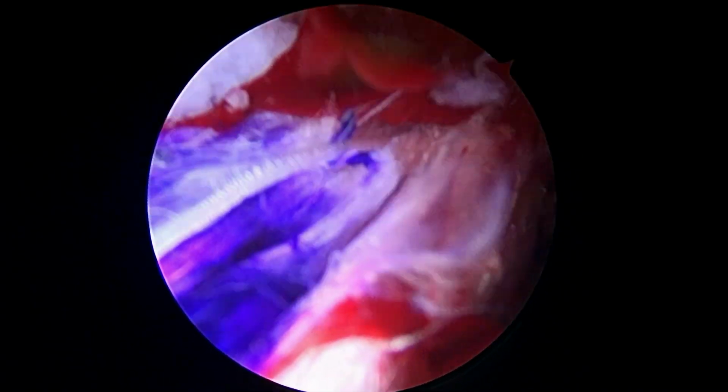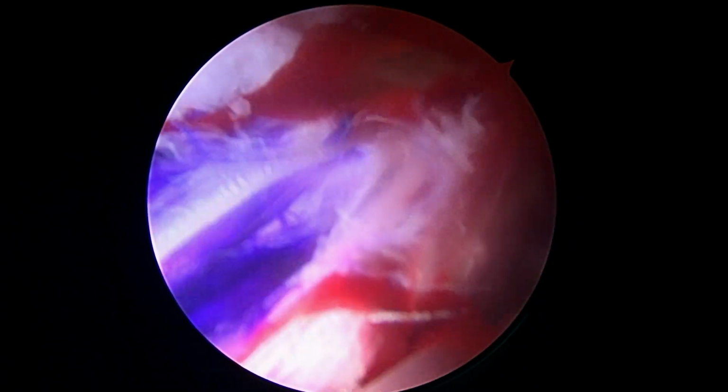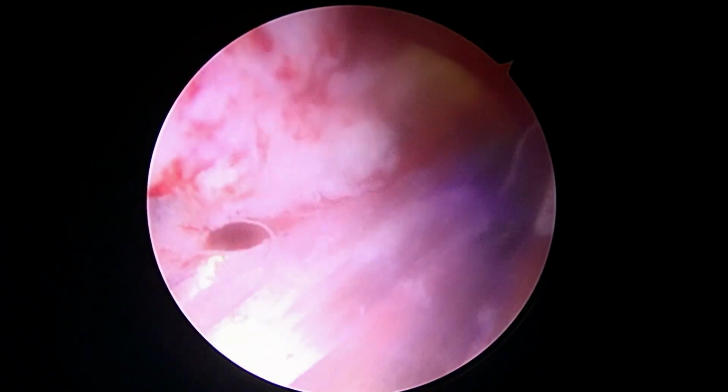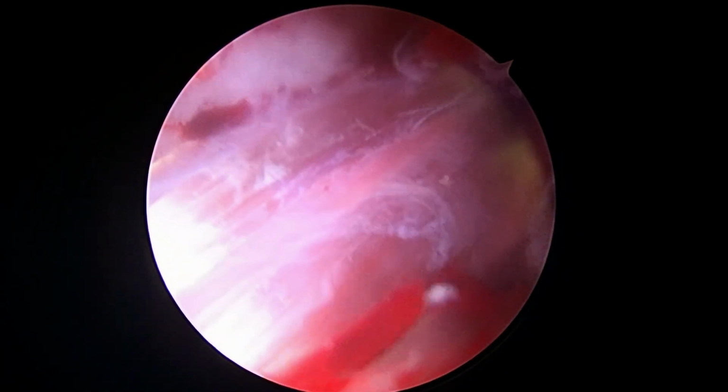Okay, hold the camera there. And we'll keep working here and get this fixed. This is an adjustable loop button, so we'll show you once it's fixed. Just pull this all the way up, right? There we go. Okay, good. Okay, great.